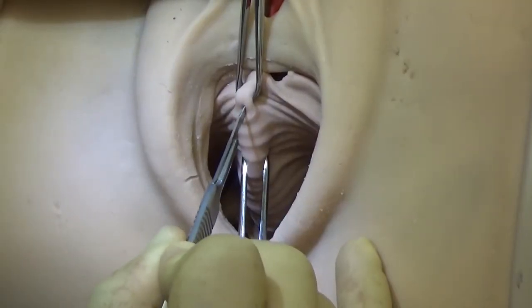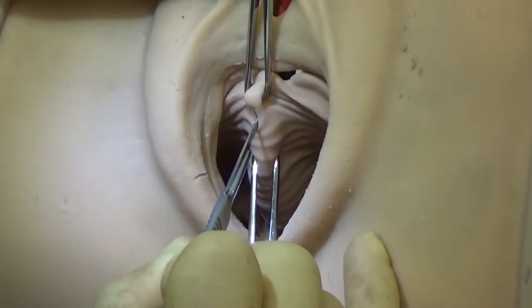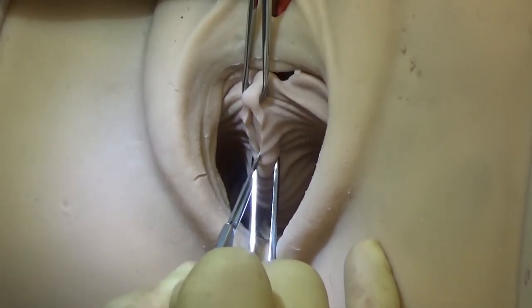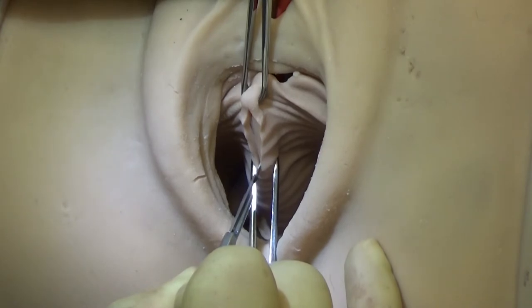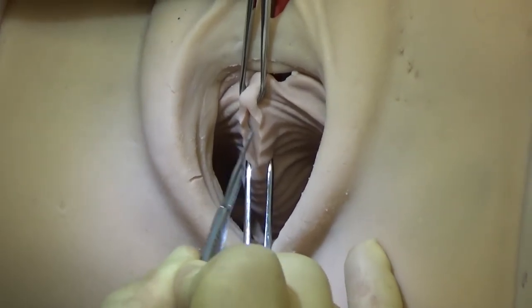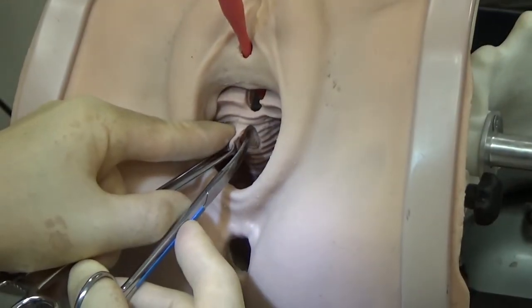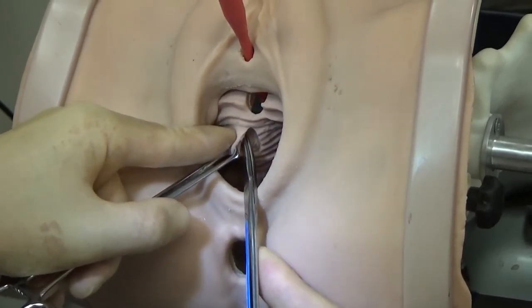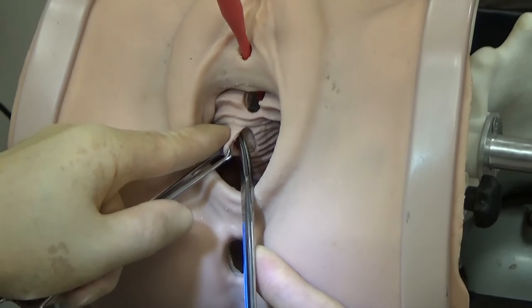A 1.5 to 2 centimeter incision is made through the full thickness of the vaginal wall overlying the midurethra. The model has a full thickness vaginal wall and an endopelvic fascial layer. The scissor tips should be oriented at a 45 degree angle to the horizontal plane and 45 degrees to the vertical plane.